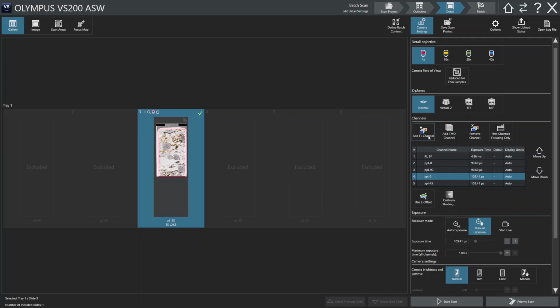And we only have to list them using this button on the top left, where you can select what orientation of the stage rotation you want to use. Either if it's cross-polarized light, you will have 0 to 90 degrees total rotation, considering 90 is equal to 0 degrees, and in plane polarized light, you will have 0 to 150, but in fact it's 180 because 0 is equal to 180 degrees. You can grow this list way larger, but it's not necessary for most cases and at this magnification as well.